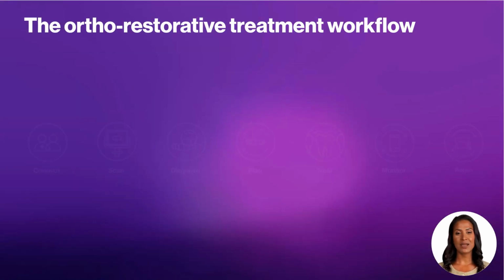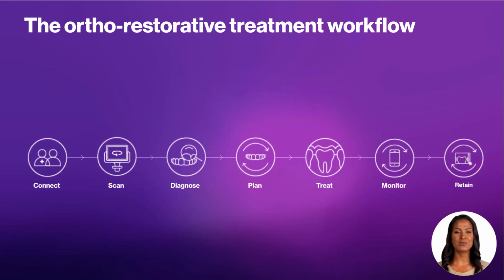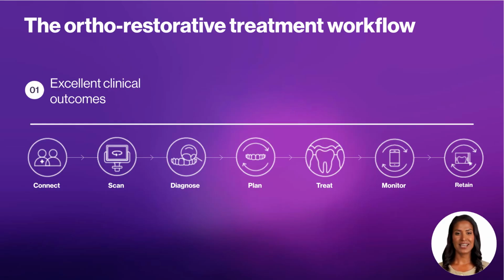The Align digital platform connects all these steps, offering an integrated ecosystem that supports excellent clinical outcomes, enhanced patient experience, and practice growth.